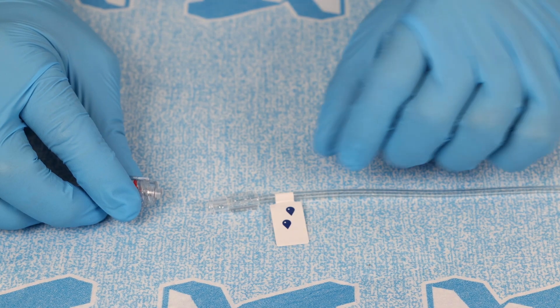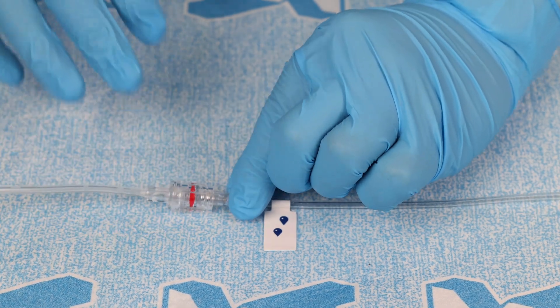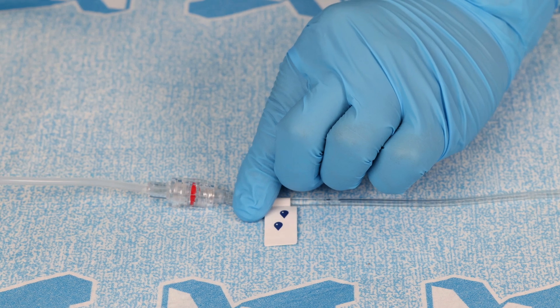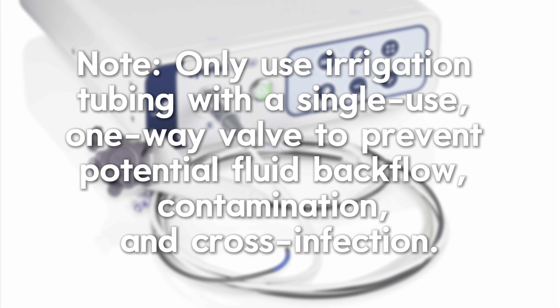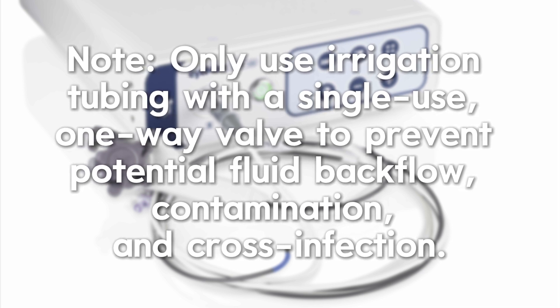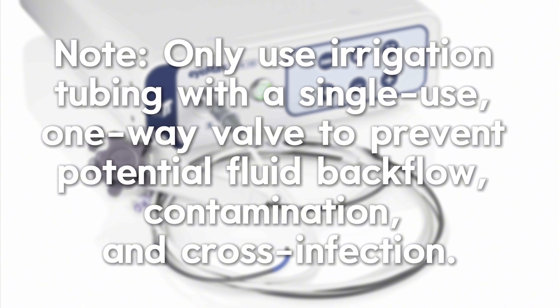To connect the irrigation tubing, connect the tubing to the irrigation port of the IMAX scope. If using a peristaltic pump, follow the instructions provided with the device. Only use irrigation tubing with a single-use, one-way valve to prevent potential fluid backflow, contamination, and cross-infection.